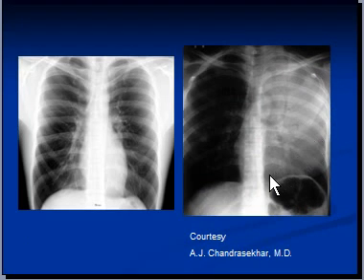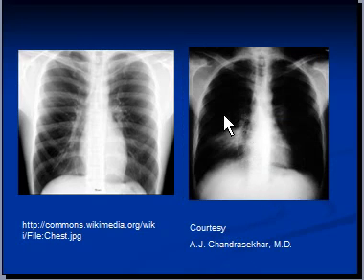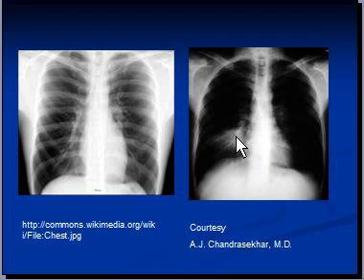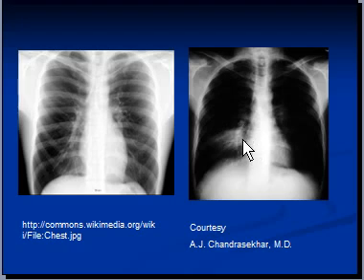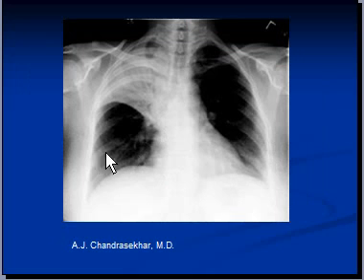Another example shows the left upper lobe entirely consolidated, while the left lower lobe is still aerated. There is also an area of consolidation in the right middle lobe, and you can see the pulmonary artery through the consolidated area. The right heart border is not clearly visible here.